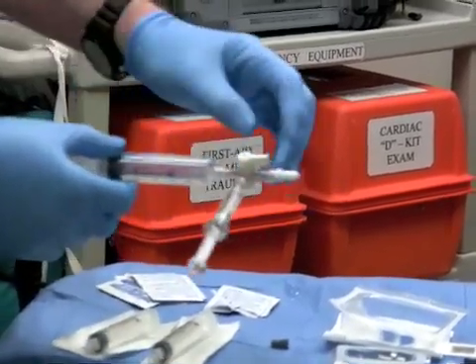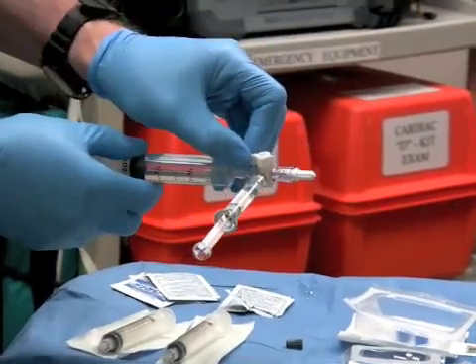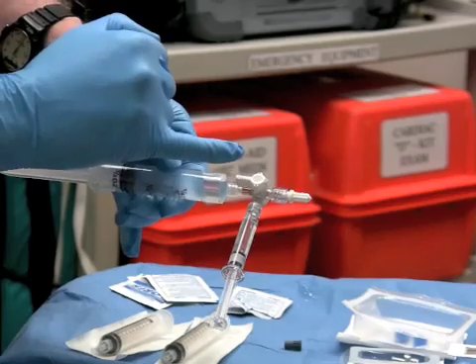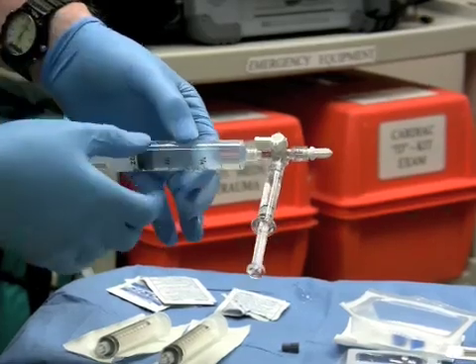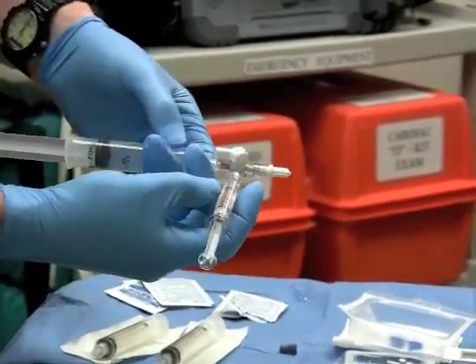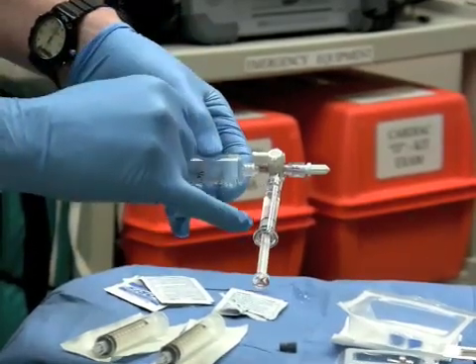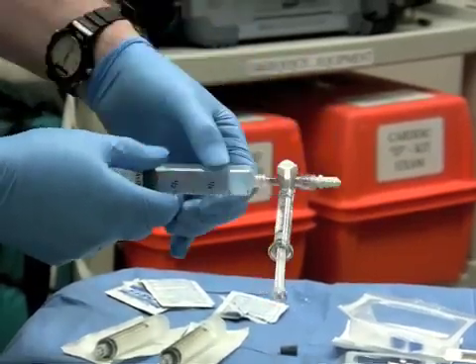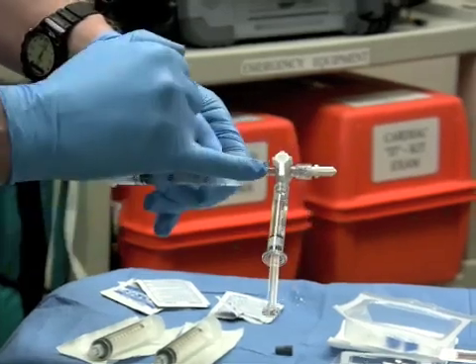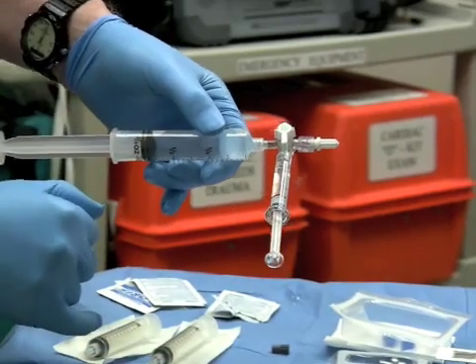The push, as you will see momentarily, is going to be first adenosine in and out. So you just line up visually the channels. Nothing will go back here. And immediately after pushing that, we do have an issue with back fill during the saline flush, but this has just prevented that by shutting off back flow to the syringe.